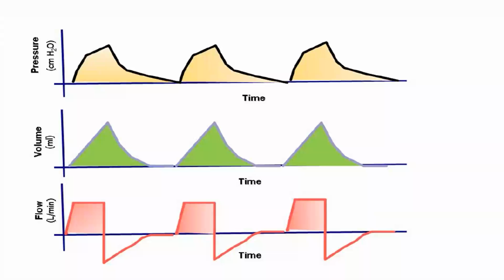I'm volume controlled. It's volume. Good. Why are you all saying it's a volume controlled mode? Square flow pattern. Better than saying square flow, a better answer would be that the flow is constant. Yeah. So you see the flow at the start of inspiration.